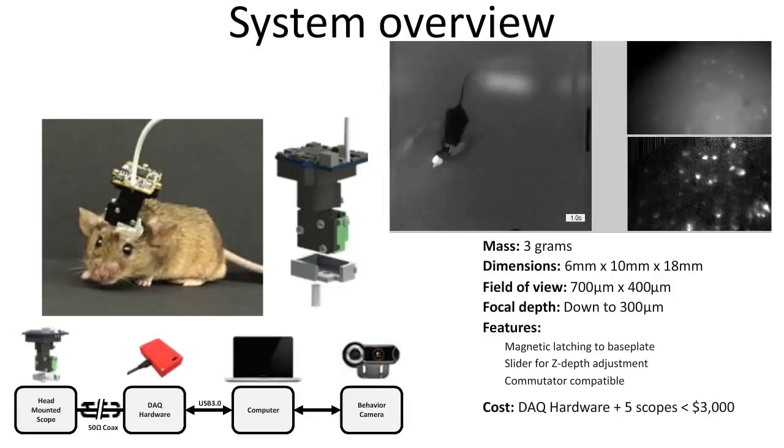And so what do these microscopes in essence look like? This is the animal on the left. You can see the mouse is carrying this microscope, and a lens, which, let me see if I can point to it, this GRIN lens here, which is a cylindrical piece of glass that acts as the focusing mechanism, gets implanted over whatever structure you'd like to image. The cells will already be expressing the genetically encoded calcium indicator that you're interested in. And later on, the animal is brought back and a base plate is implanted over the head of the animal, which holds the microscope in place. And this is adjusted while the microscope is on the head of the animal to image the maximal number of cells. And eventually, when the animal needs to be imaged, the microscope clamps onto this base plate.